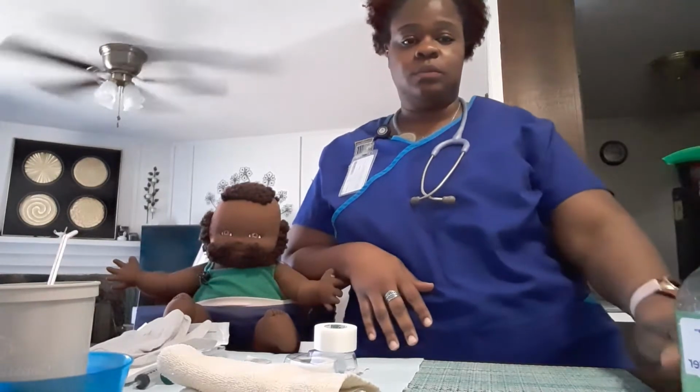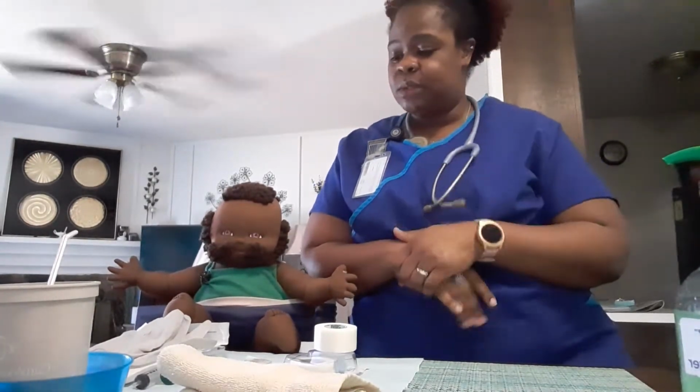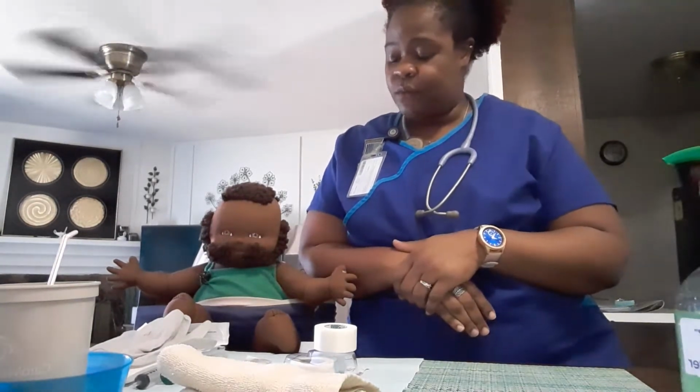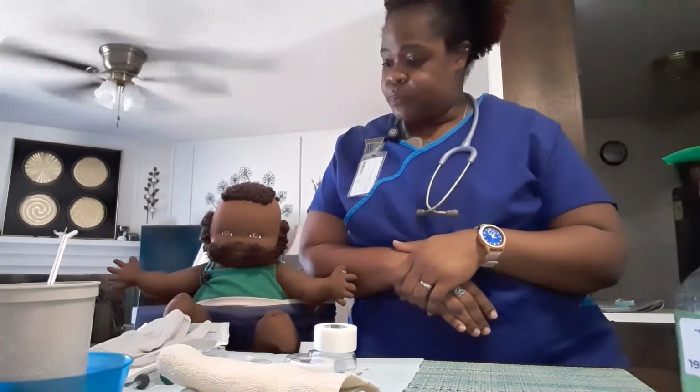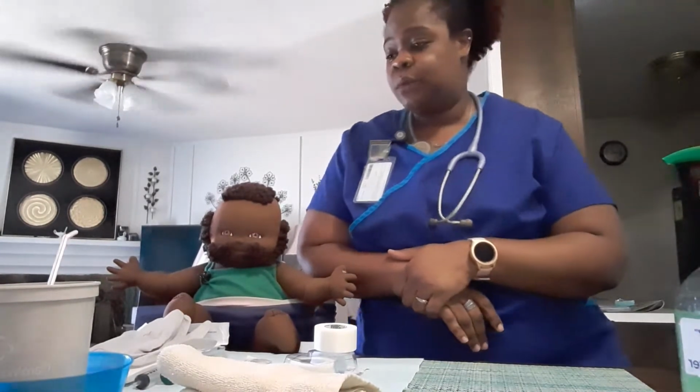Hey, Mr. Chamberlain, my name is Amelia. Dr. Feelgood wants me to put in an NG tube to help with some decompression of your bowel. Can I get your name and your date of birth? He would give us his name and his date of birth.